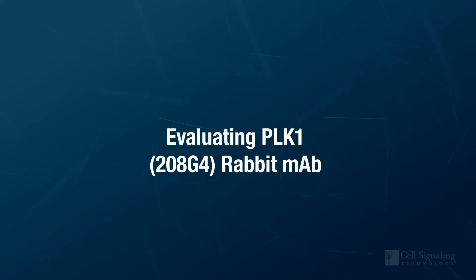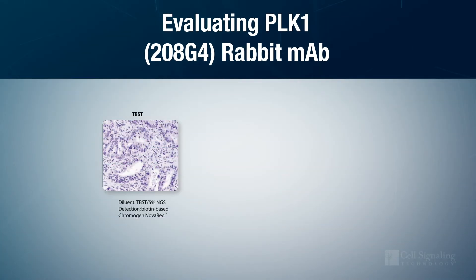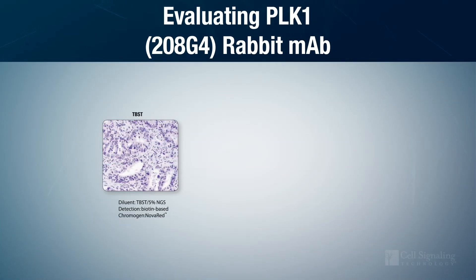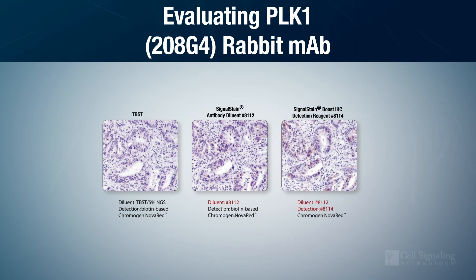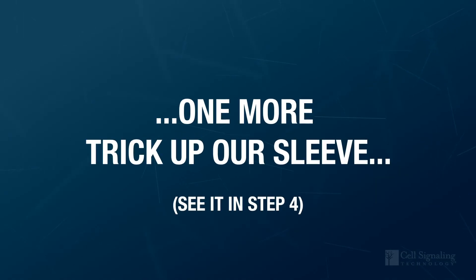When we used a biotin-based detection system to evaluate the PLK1-RabMAb, we found it didn't provide a strong enough signal, even with the other changes in companion reagents that we had made. As a result, we switched to the more sensitive polymer-based detection method. Despite an appreciable increase, it was not sufficient to meet our standards. But we had one more trick up our sleeve.